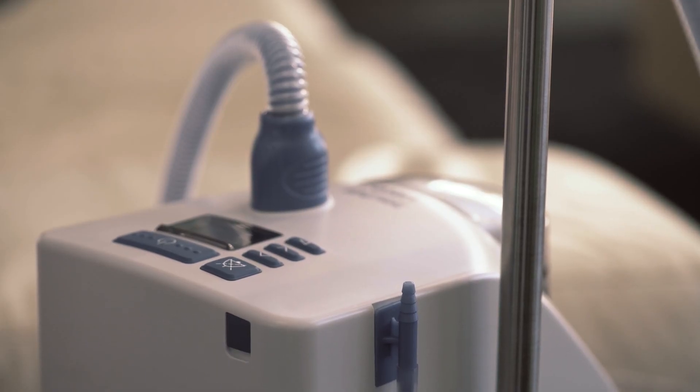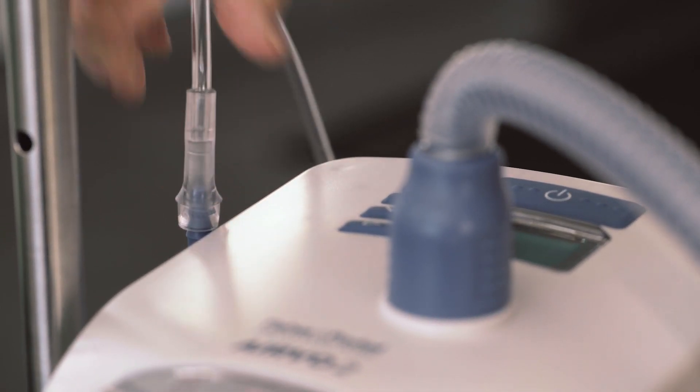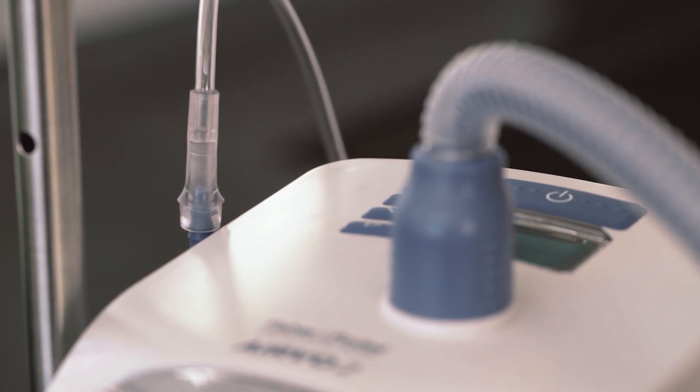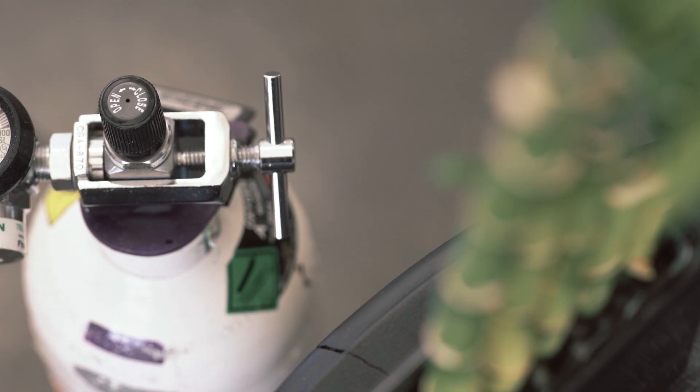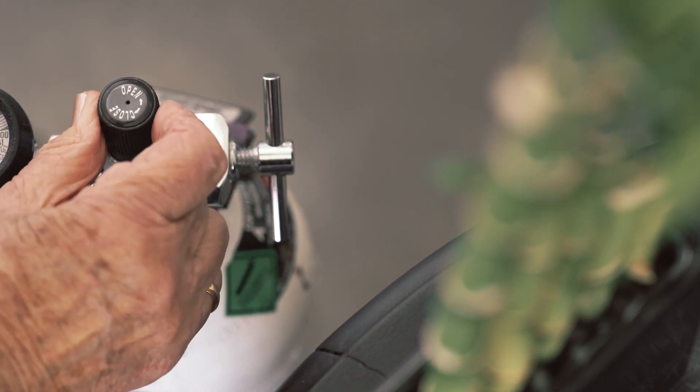If you are using supplementary oxygen, connect the output from the oxygen source to the oxygen inlet port on the side of the unit. Ensure the oxygen tube is firmly pushed onto this connection port. Turn on the oxygen flow meter and set to the flow rate prescribed by your physician.